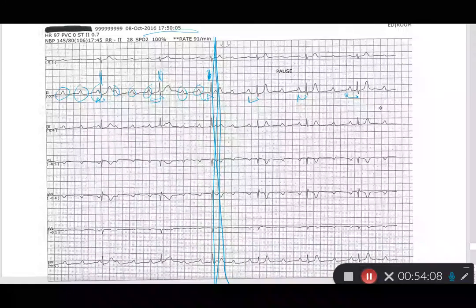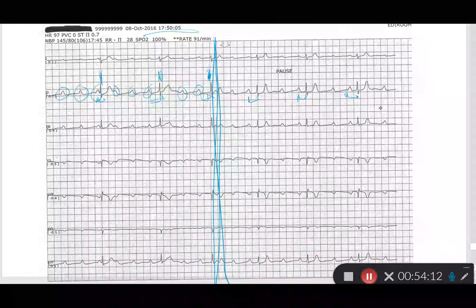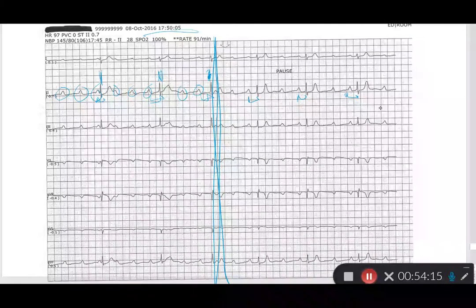So obviously I would never throw this strip at a test. I just thought it was very interesting because we watched multiple heart blocks in one patient, and it isn't uncommon for a patient to move between heart blocks. A lot of times I see a second degree type 1 go into a second degree type 2 and then move back and forth. That's actually pretty common. For testing purposes, obviously, I'm only going to give you one heart block per strip, but I just think it's interesting to see a real patient scenario where they moved through all these heart blocks.